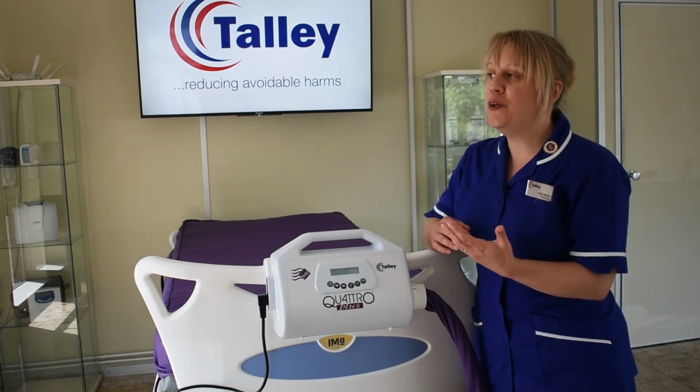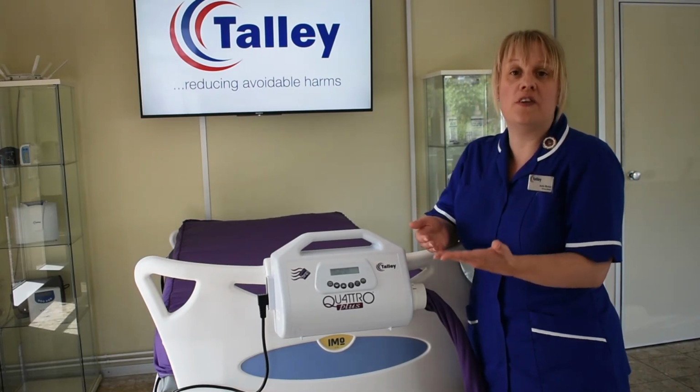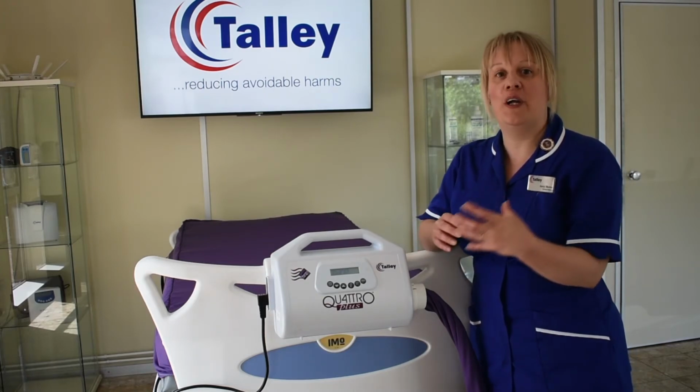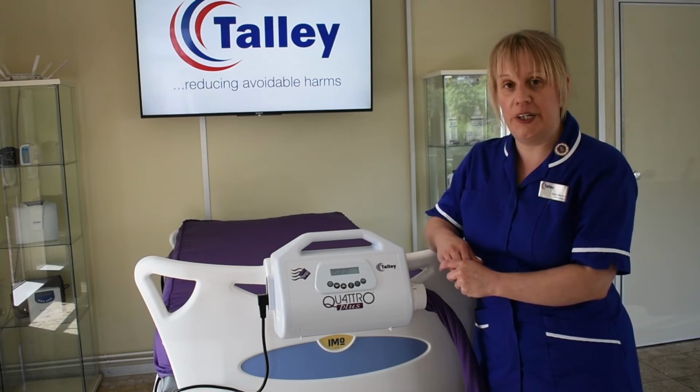It might be that you're rolling a patient over during personal care, and so you want that firm surface to give them the support in that respect too. It also could be that they're doing exercises in bed, so really any sort of task where you might need that firm static surface for, you can put it into max inflate.